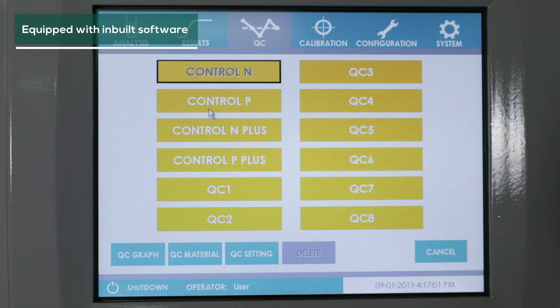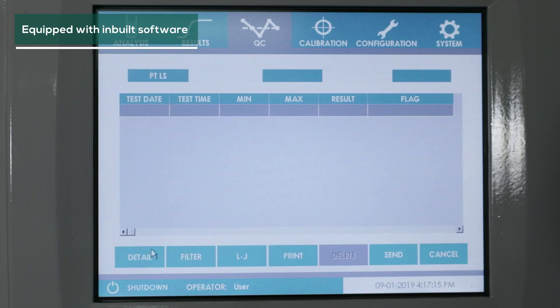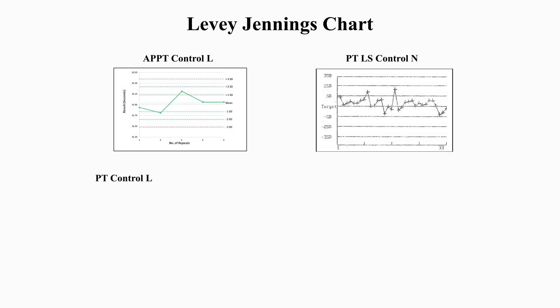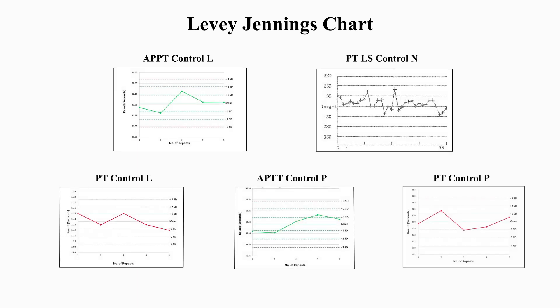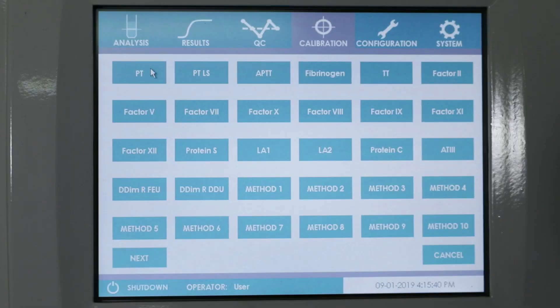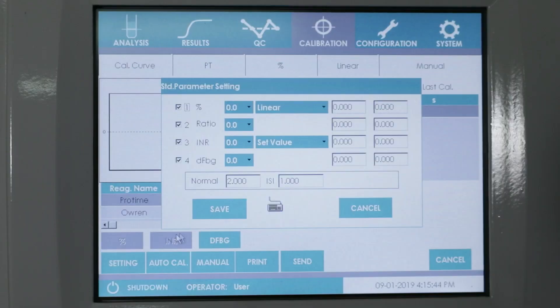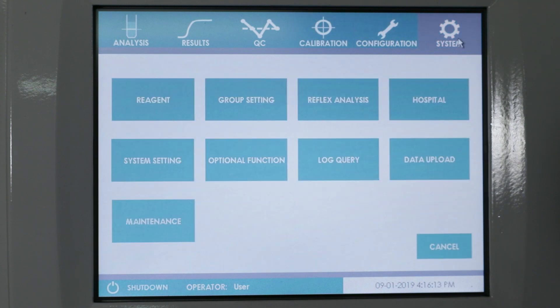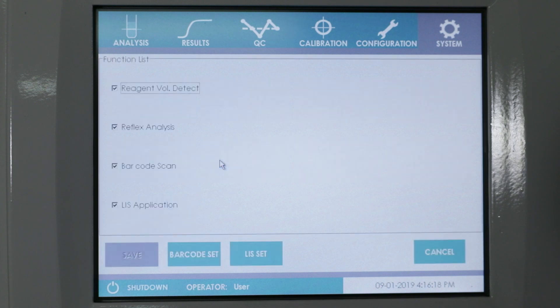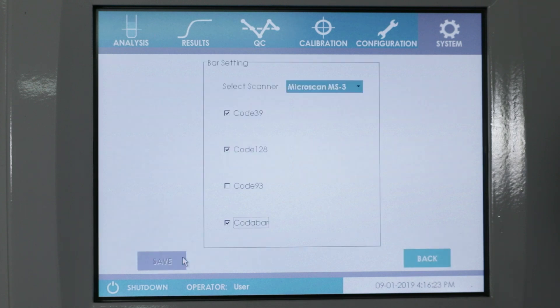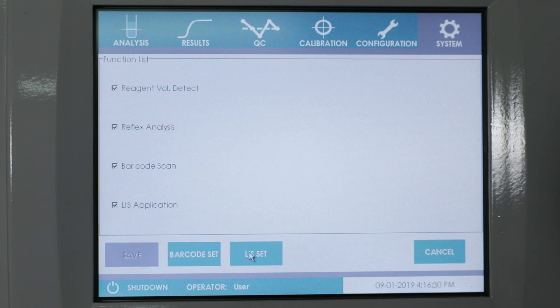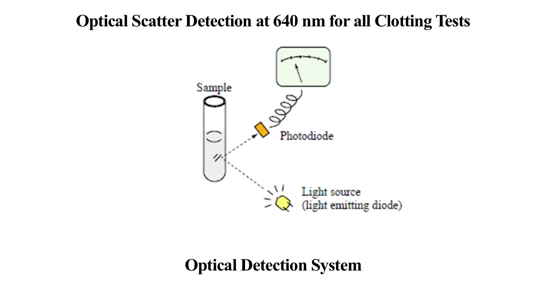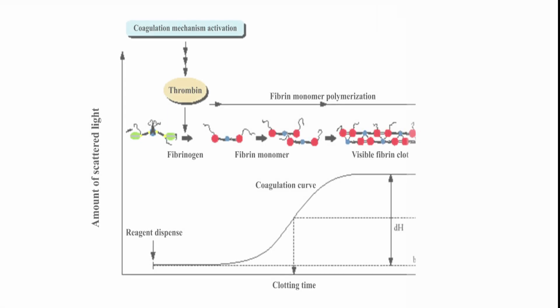Equipped with inbuilt software to manage various details about patient, barcode, test selection, test, repeat, retest, reflex testing, and results. Runtime clot curve plotting makes it completely automated. Percentage change in light scattering helps in plotting detailed clotting curves to help the user know and interpret the result better.